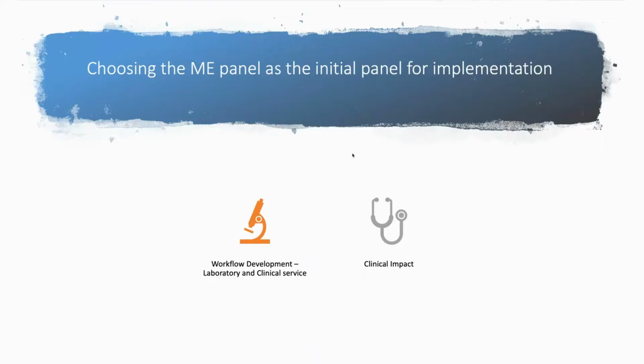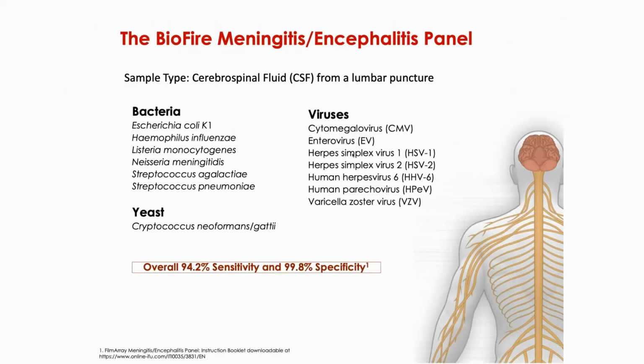We had the ME panel available in late 2015, early 2016. What better way of working out an operational workflow, offering this one panel up front, but also looking at the clinical impact that this multiplex PCR panel, the BioFire ME panel, would allow.